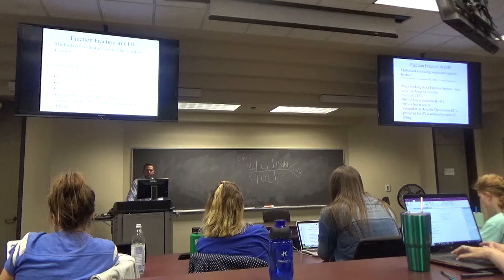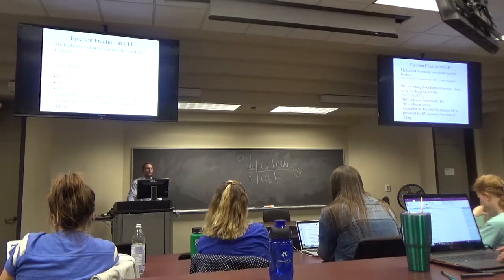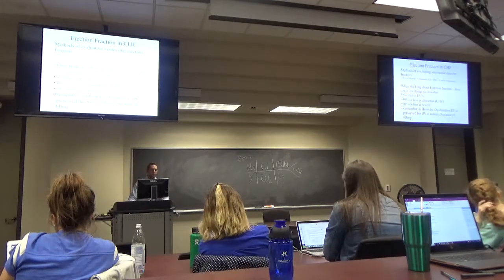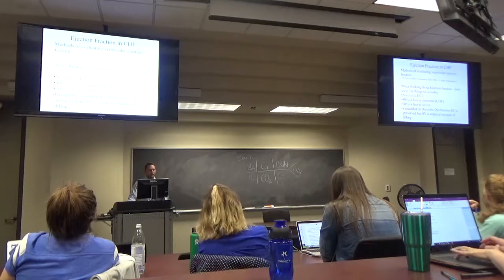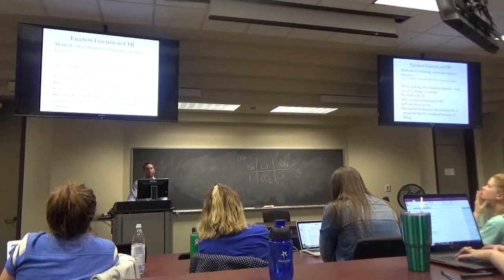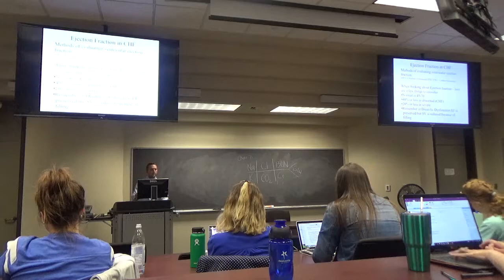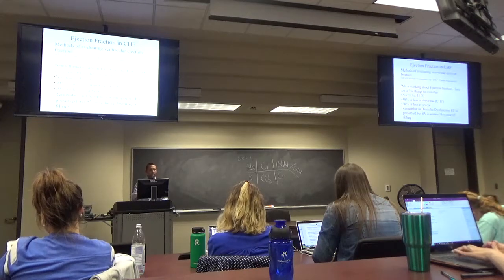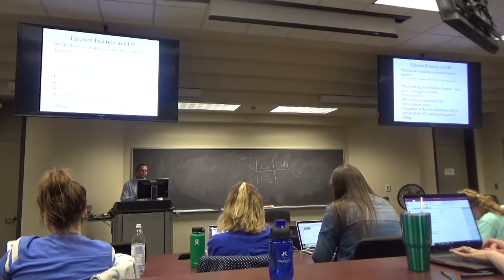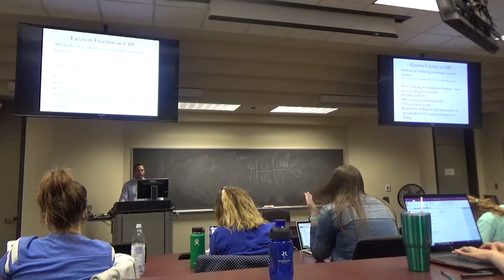So, ejection fraction in CHF. There are a bunch of different ways you can measure ejection fraction. We talked about gated imaging, which is the most accurate means. There's also ultrasound: transesophageal echo and transthoracic echo. The transthoracic echo is the one that they do at bedside, and it's very easy to do.